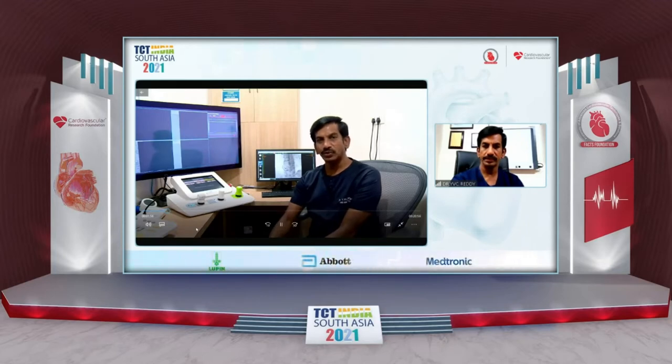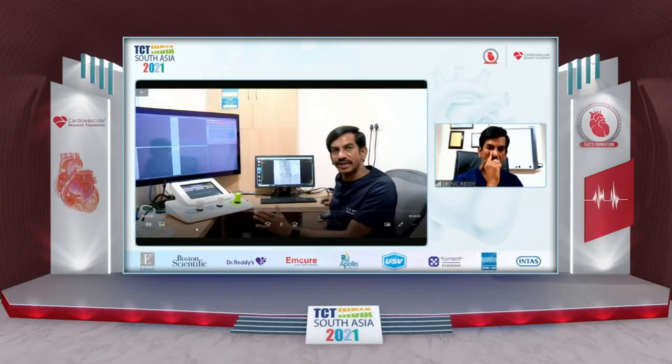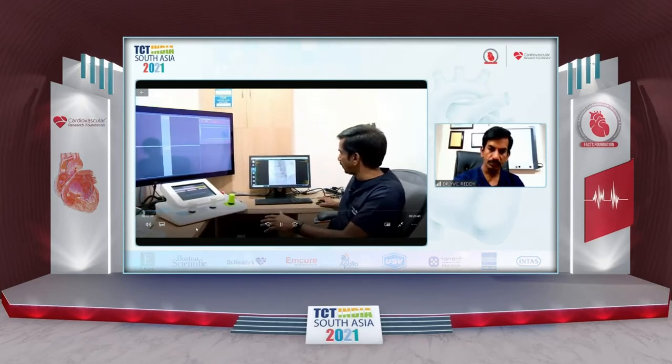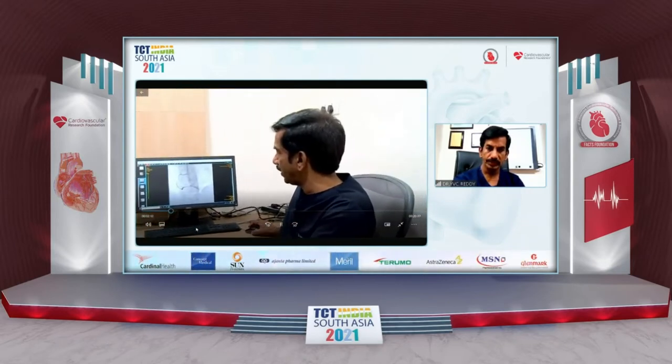She's a 52-year-old diabetic lady with chronic stable angina of 3 to 4 months. Strongly positive treadmill tests, ECG normal, echocardiography normal without any wall motion abnormalities, angiography done a few days back. So let's show the angiogram, almost like a co-dominant right coronary artery with a Shepherd's crook. Proximally, you can see the upward going Shepherd's crook, critical mid-RCA lesion.